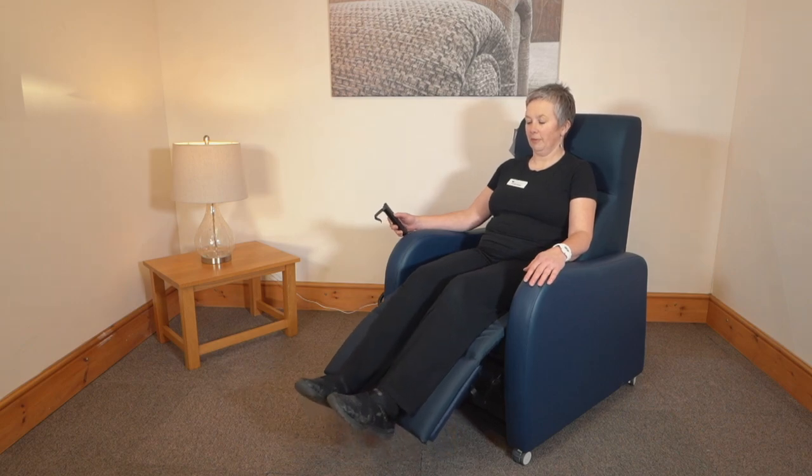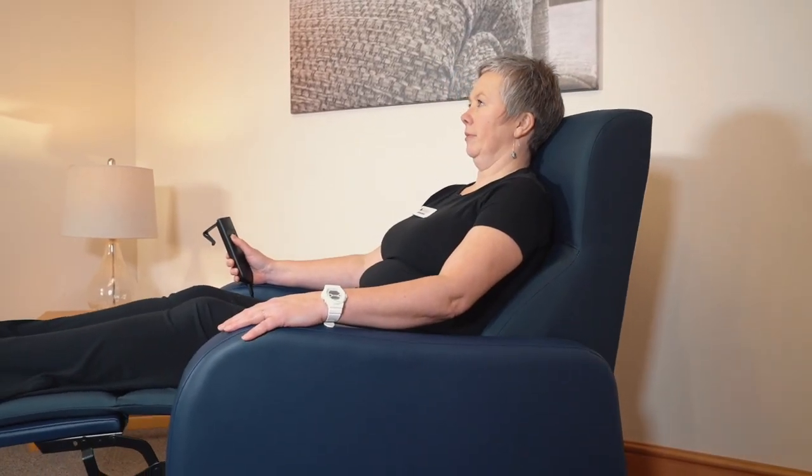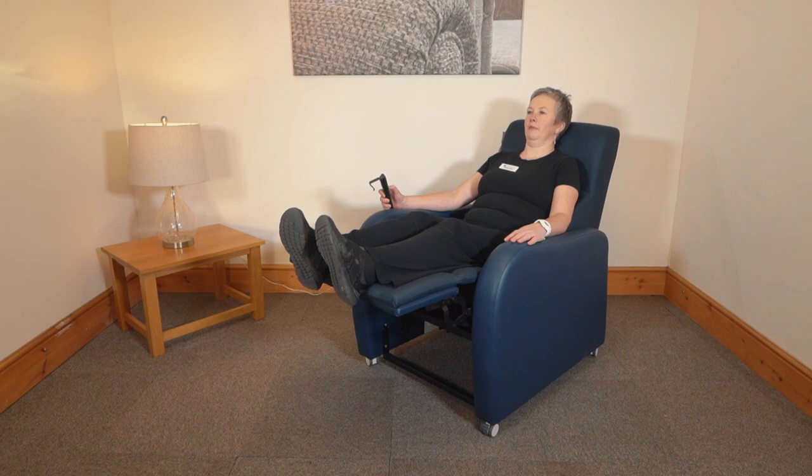The electric version of the chair has two alternative mechanisms: one is recline only and the other is rise and recline. The manual version is recline only.